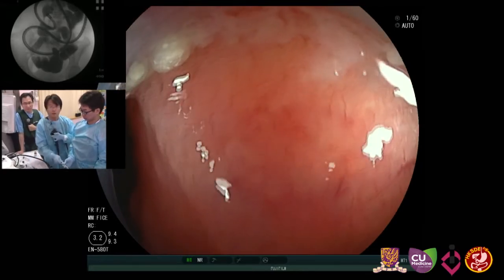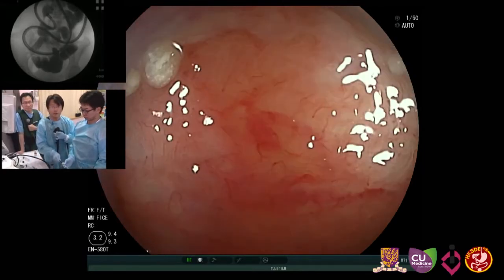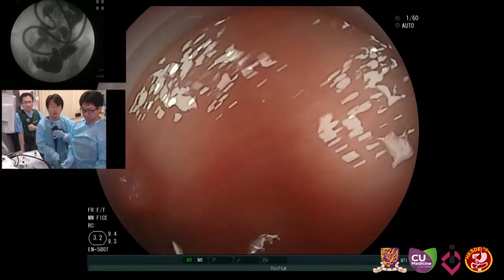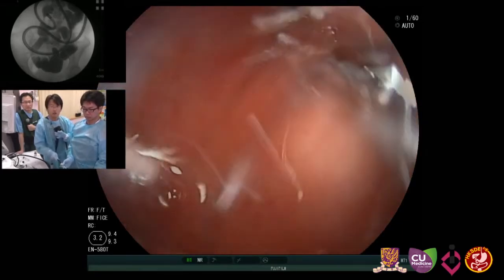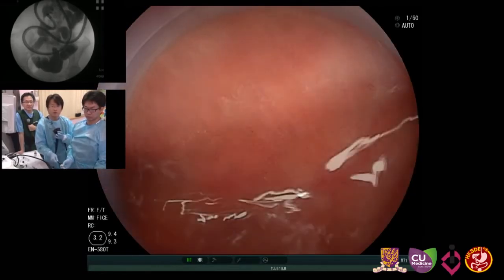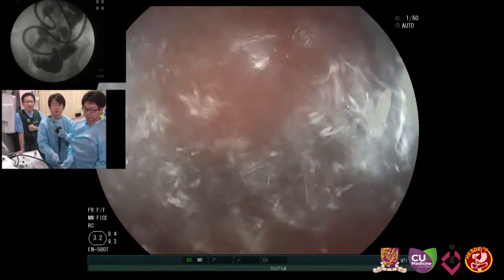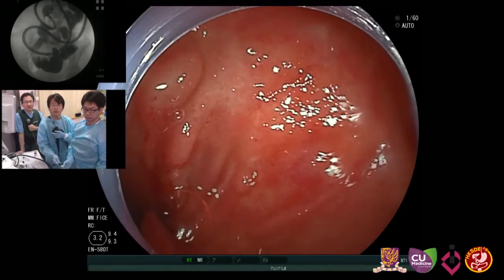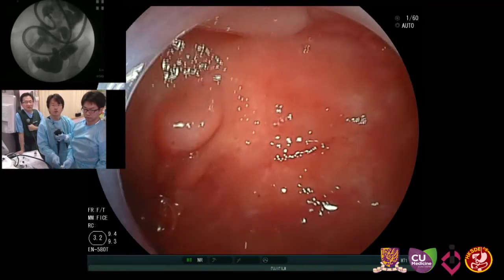So now the endoscope balloon is deflated. She has a lot of adhesion. So you can see the scar. Yeah, this is a surgical scar, a whitish appearance, right? No, mucosal scar. Mucosal scar. That is because of the Crohn's disease, you see.